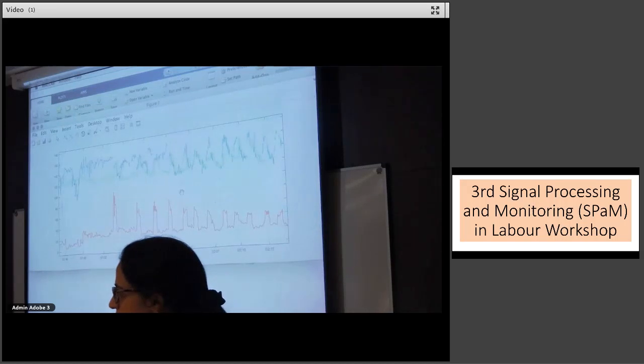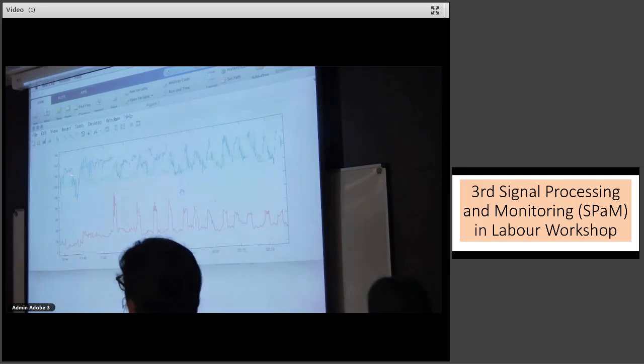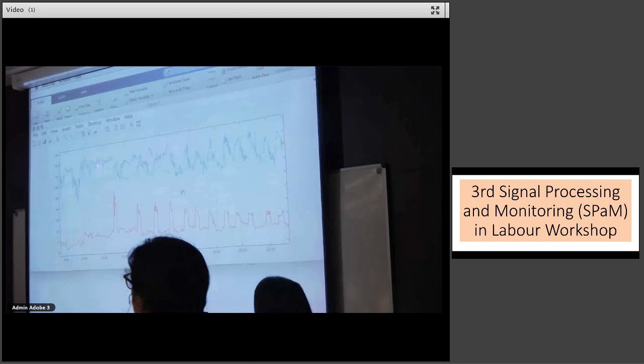Is that what you use? What do you use? 2 minutes. Yeah. What are you using? No. So you're going to, what? No, during the deceleration? Yeah. Well, yeah, reasonably.